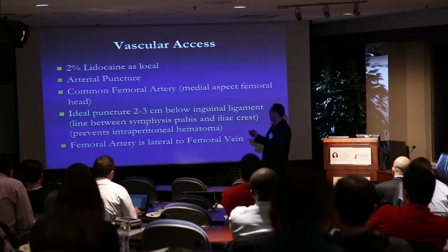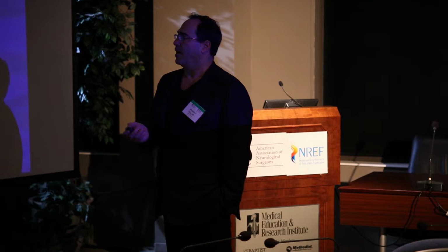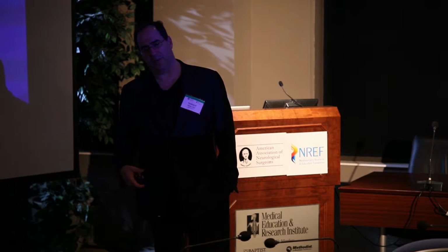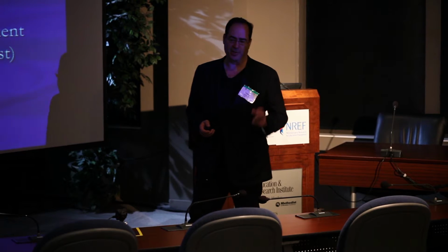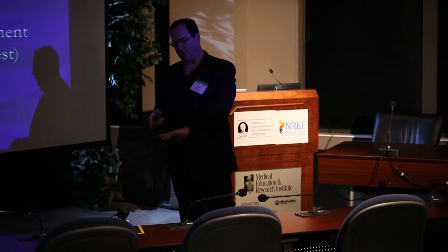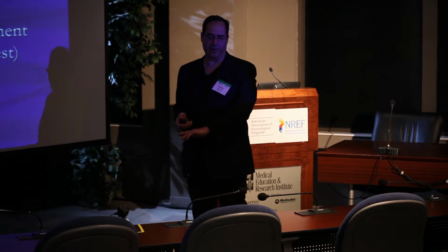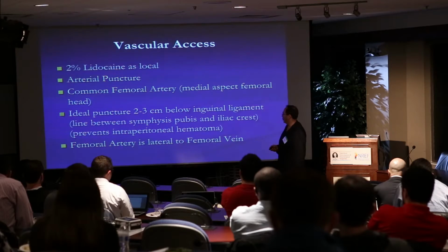Vascular access, obviously if you're doing conscious sedation, you're going to use lidocaine. I don't use local if the patients are under general anesthesia. The way I was taught was that you could use the lidocaine not only for numbing the skin, but you can inject on either side of the artery and fix the artery. I still do that, so I'll always come in, feel the pulse, and inject lidocaine on either side of the vessel to try to keep the artery from rolling.